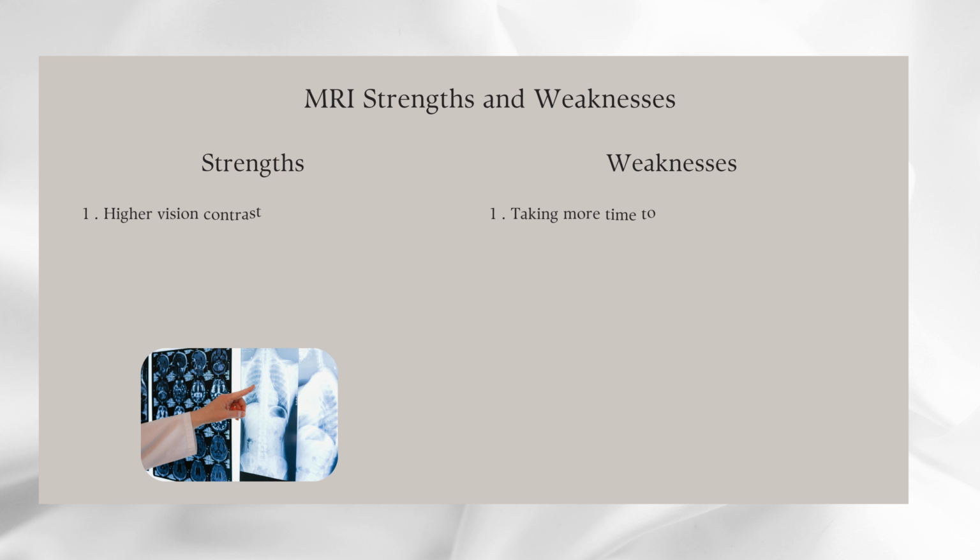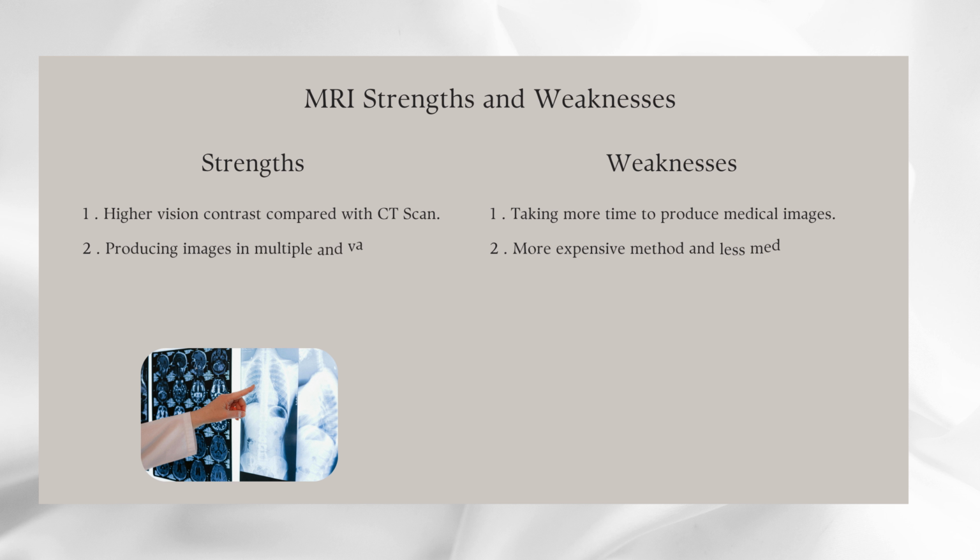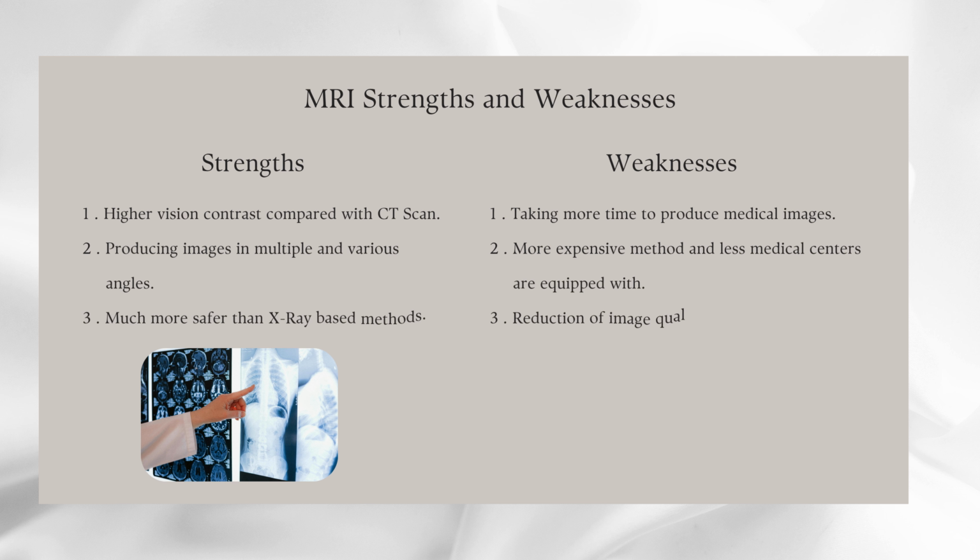Like other imaging techniques, MRI has some strengths and weaknesses too. Strengths are: 1. Higher vision contrast compared with CT scan. 2. Producing images in multiple and various angles. 3. Much safer than X-ray based methods.